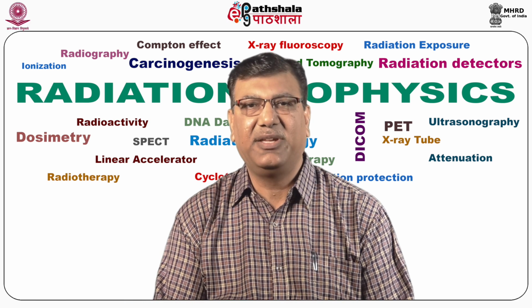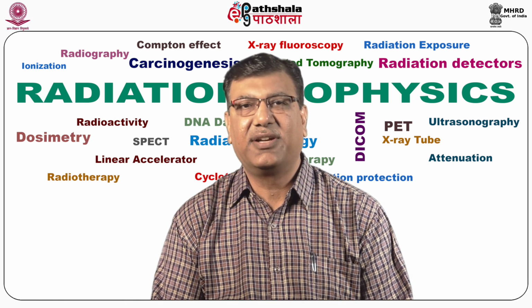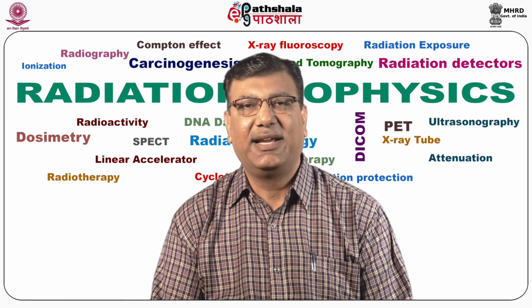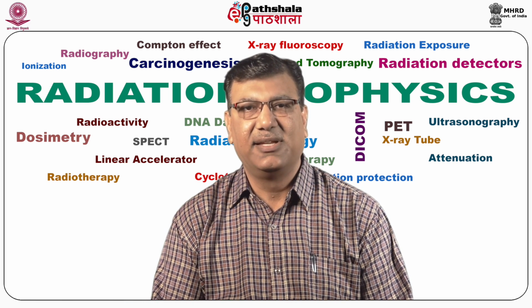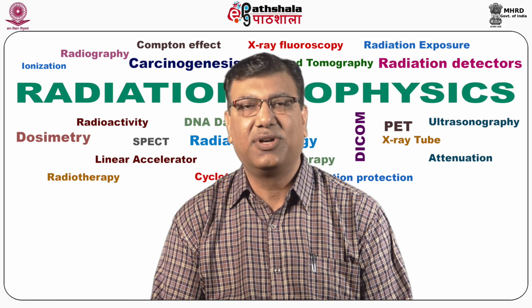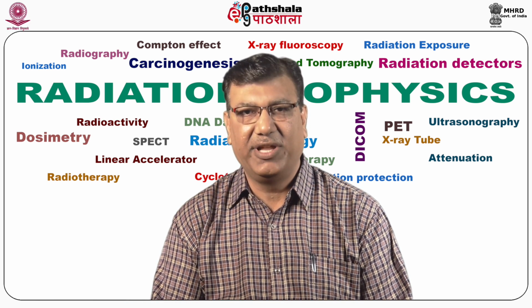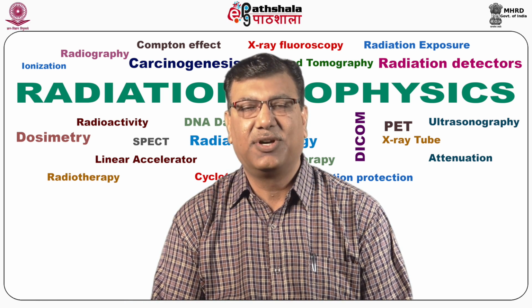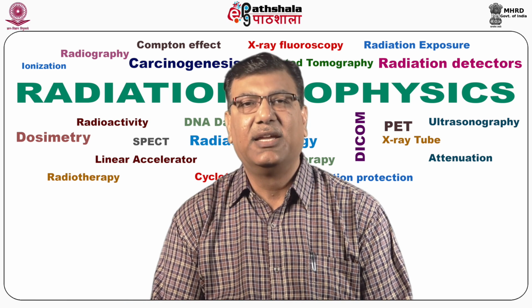One is teletherapy, where the radioactive source is at some distance, and second is brachytherapy, where the radioactive source is very close or in contact with the body. Brachy literally means very close or inside the body.